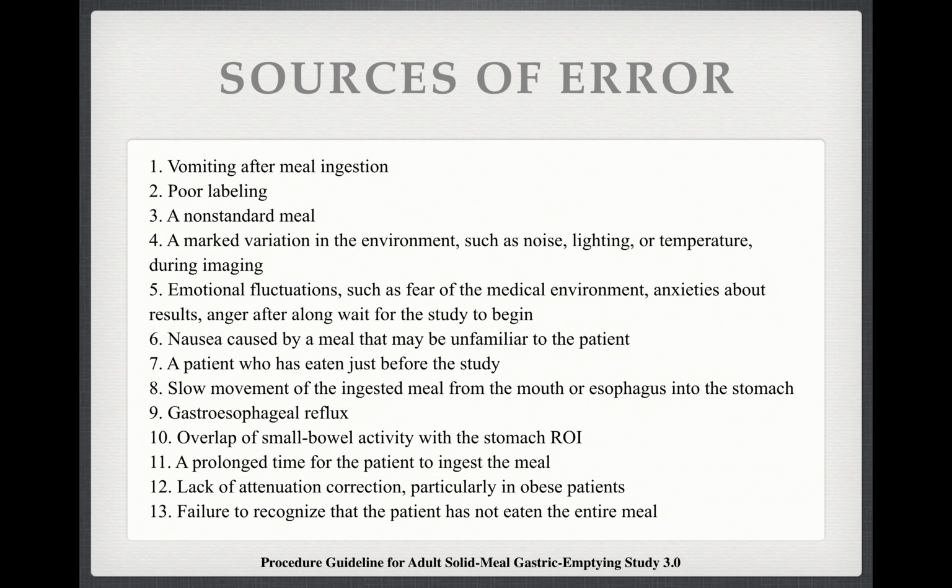Okay. Sources of error, again, the largest source of error is a non-standard meal or not making the meal correctly. Otherwise, if the patient doesn't consume the entire meal, this can result in a somewhat abnormal and suboptimal test. Okay, liquid gastric emptying used to be popular before the modern guidelines came out, but again, it probably is not as reproducible as a solid meal and generally should not be performed.